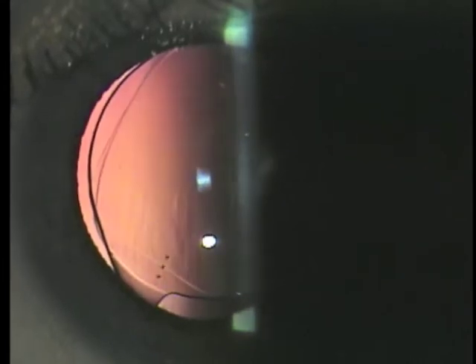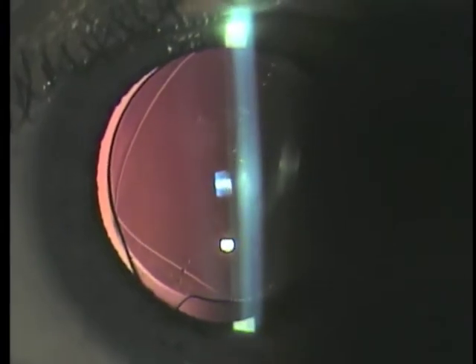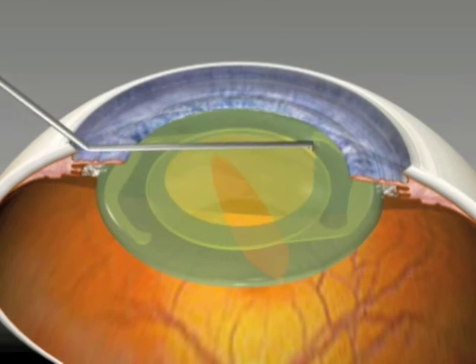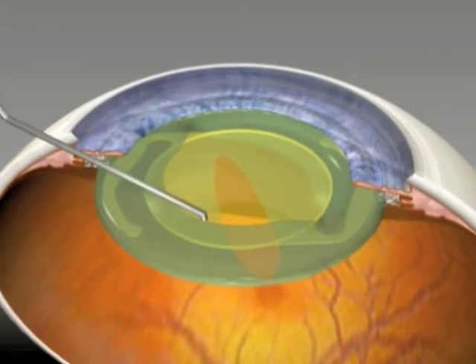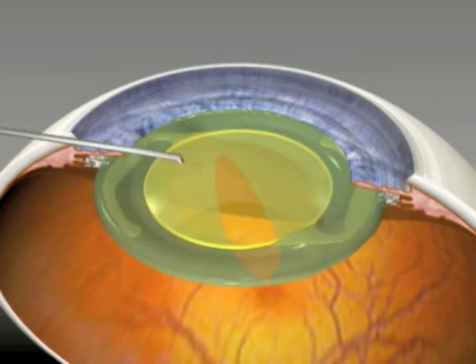You can see the configuration of the anterior CCC as it's capturing the optic. It's hard to know whether the optic is in front or behind, but just realize that in this case the haptics are in the bag and the optic is pulled out, as shown in this animation.